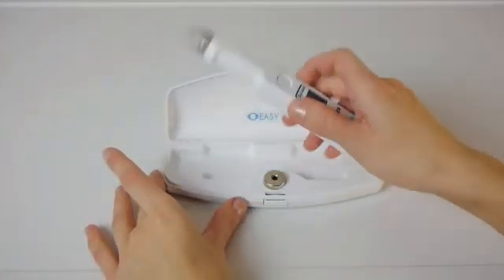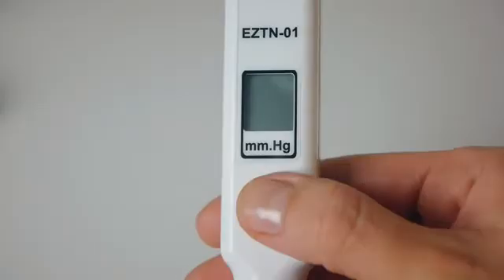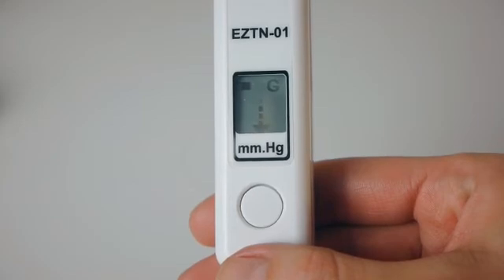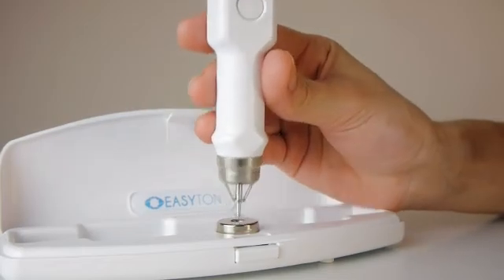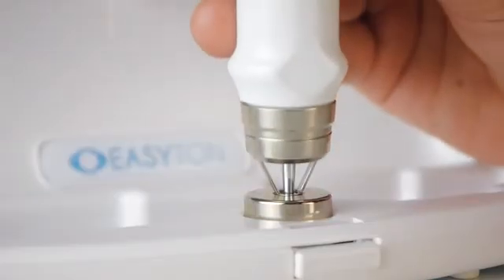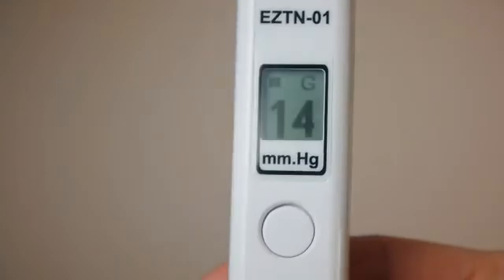Additional information. To obtain the most reliable results and to fully appreciate all the advantages of transpalpebral scleral tonometry, you only need to master the use of this tonometer. Please read the operating manual carefully. Use the tester to carry out a few test checks of the tonometer's operation and make sure to observe all the recommendations described in the manual. Also, avoid constrained movements when handling the tonometer. Practice the tonometry process on testing samples until you do it automatically.